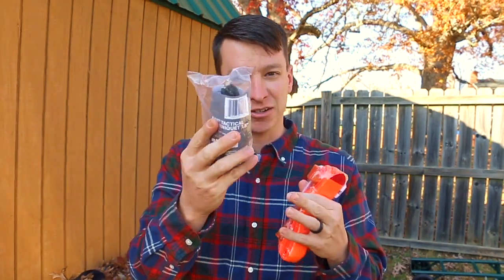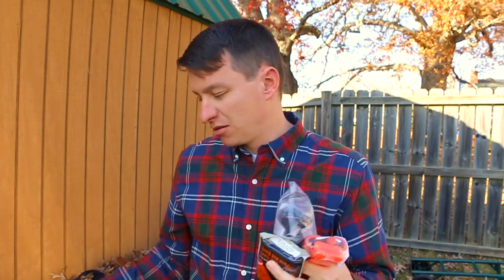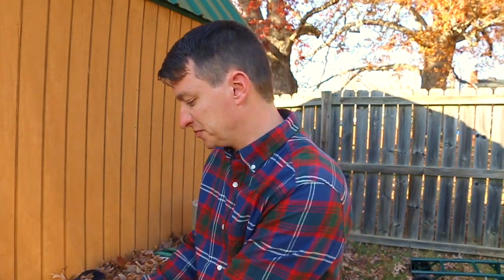Go ahead and take them out of the packaging — it's not going to hurt them. Take them out, get them ready to deploy, whether you're using the SWAT-T, the CAT, the SOF-T, or the RATS. Get them out of the packaging and ready to deploy, because when you get ready to use one, seconds are literally going to count, and seconds can save lives.